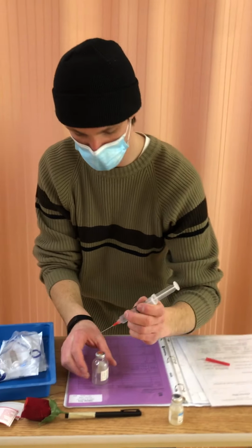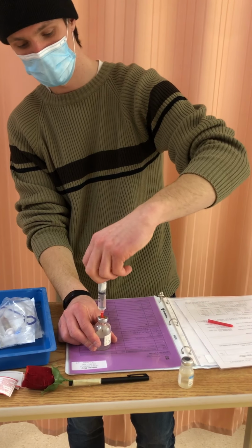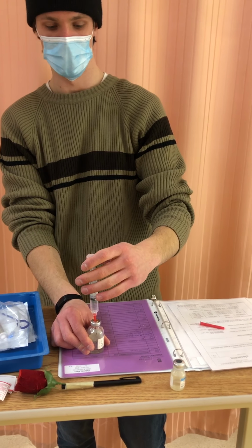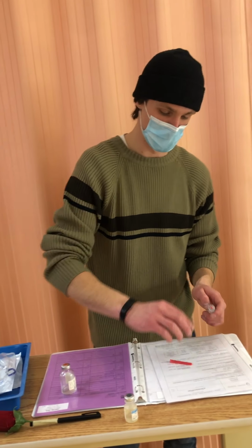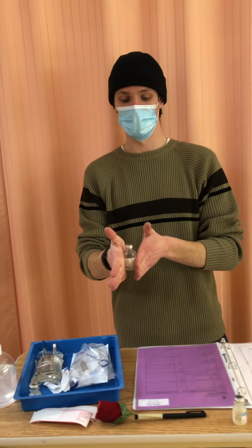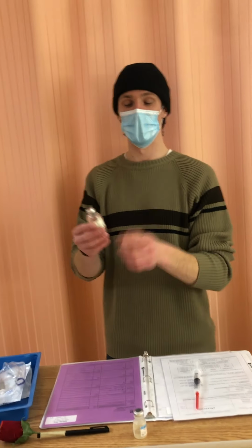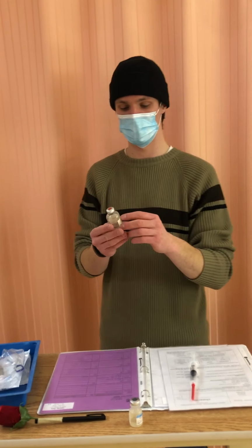Without any bubbles, and I'm going to inject that into the cloxacillin here and mix, and then draw out 6.8 or roughly 6.8 milliliters of air to maintain that vacuum seal. I'm going to recap this here without contaminating it, and I'm just going to mix the cloxacillin in my hands here. Just roll it back and forth until it's properly mixed and there's no sediment of medication. I also had noted before that the cloxacillin had not expired, so it's safe to continue to use.